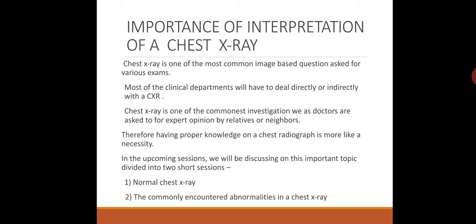Most of the clinical departments will have to deal directly or indirectly with the chest X-ray. Chest X-ray is one of the commonest investigations we as doctors are asked for expert opinion by our relatives or neighbors. So therefore, having a proper knowledge of chest radiograph is more like a necessity for us.